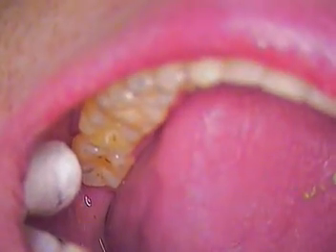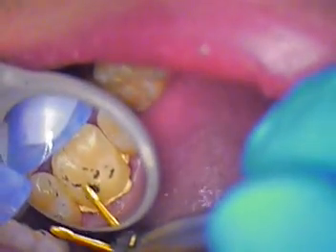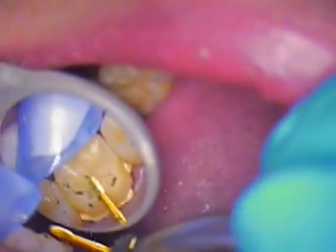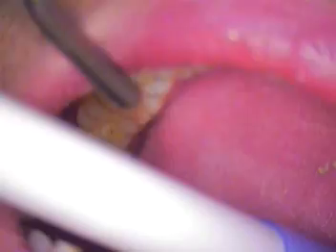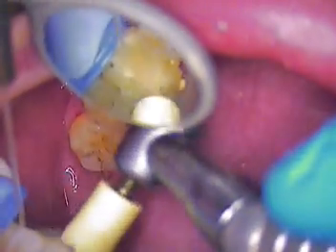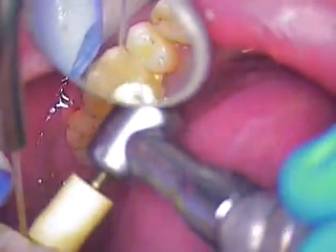Okay, close all the way down. Grind a little. Open. And let's see if we got this. Same marks. Still adjust it. Adjust it again. Close all the way down. Grind your teeth. Open. Perfect. Now we'll just polish that with some water, because we don't want him to play with his tongue in that area. Get it nice and smooth.